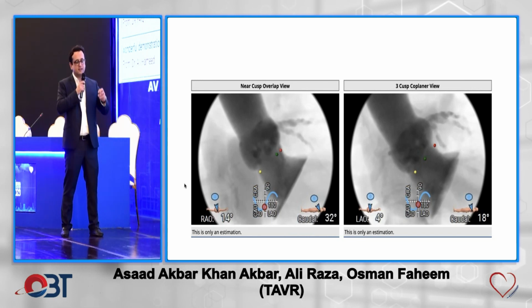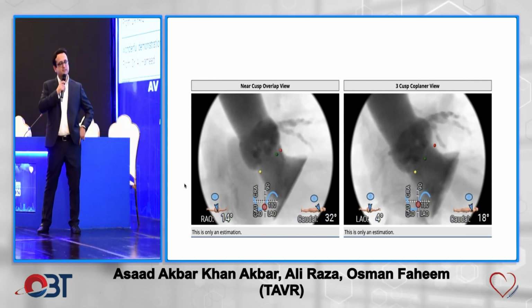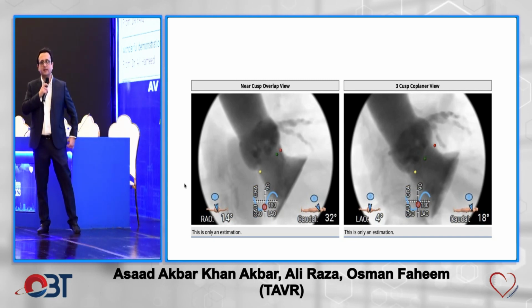And Medtronic's standard practice guidelines say what they want you to do is start in the cusp overlap view, and you always check in your LAO view before you decide on the final deployment. So you have to achieve this angle for a very short amount of time, and I think this is pretty doable. So I will probably start with this one and then move to the LAO. Yeah.